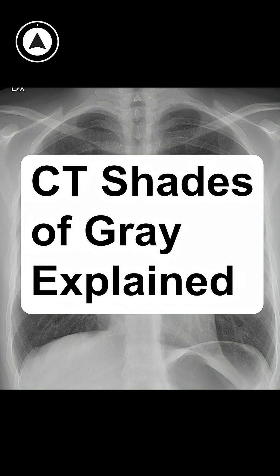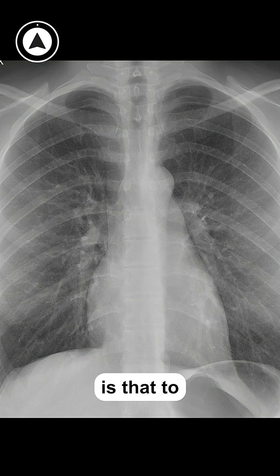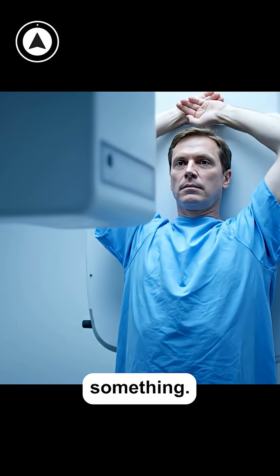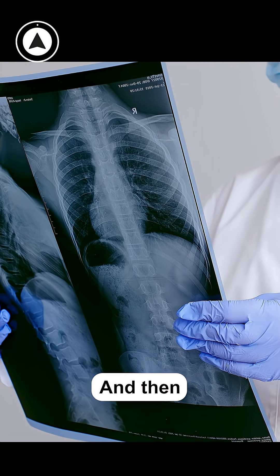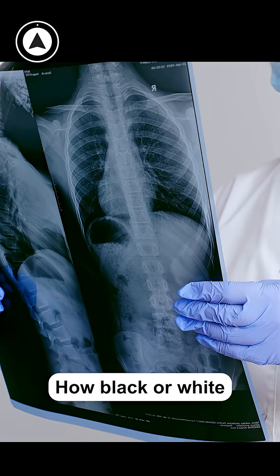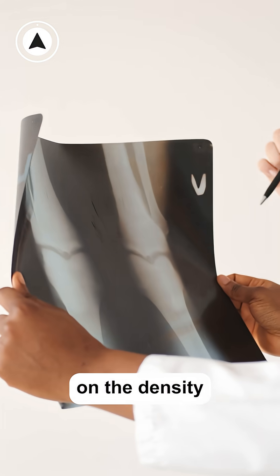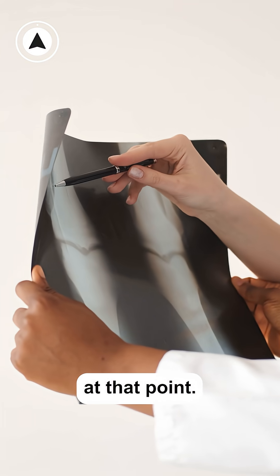We start here with an x-ray image. The main point is that to create an x-ray image, an x-ray beam is emitted through something — in this case, someone's chest — and then it's detected on the other side. How black or white an area on the film is depends on the density of the tissues between the emitter and the detector at that point.